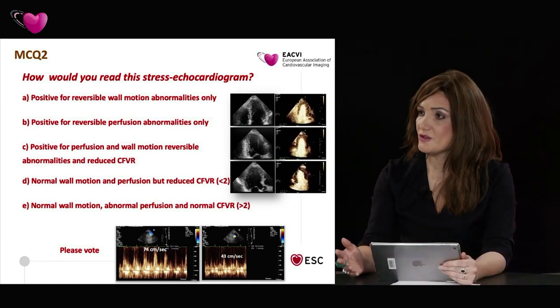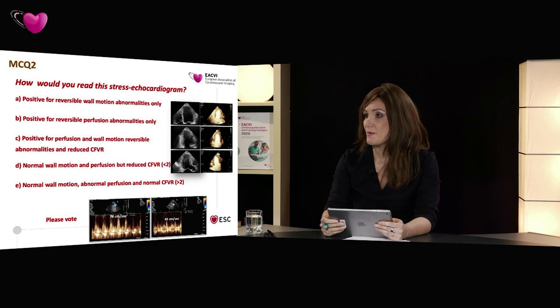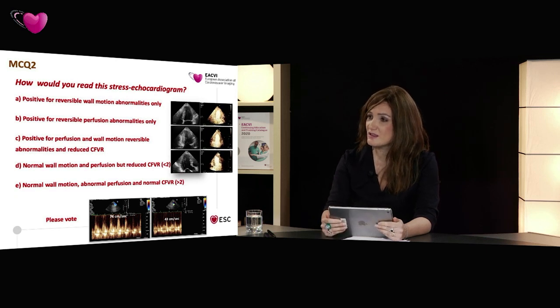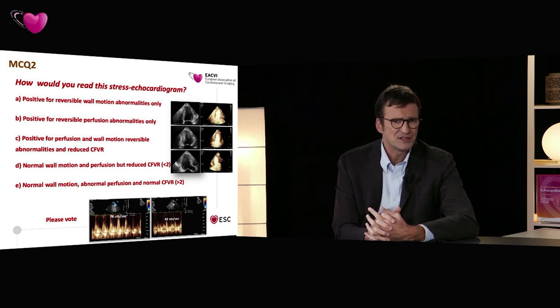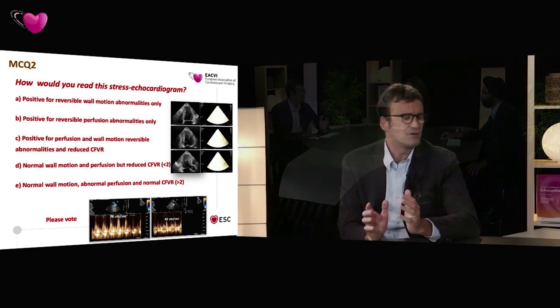Take your time. So, Nicola, they have 1 minute to answer, but it would be interesting for our viewers to know how you take the measurement of coronary flow reserve with Doppler, because maybe it can be a little bit tricky with the contrast? Well, yes, it's not a widespread technique, unfortunately, because with contrast, it's very, very easy to do. You need to have the appropriate setting in the machine, which is the same setting used for coronary flow velocity reserve without contrast. Simply lower the mechanical index as you do every time you use contrast.